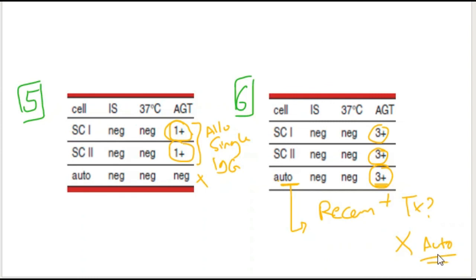So we go back to the patient history and see if the patient has a certain disease, like multiple myeloma, or not. We can also look at the strength of the reaction. We can see all of them have the same strength, and this is another indicator of the presence of autoantibody, because autoantibody usually causes pan-agglutination. So also if we test it against more cells, it may give the same reaction. So this is again an indicator of the presence of autoantibody.